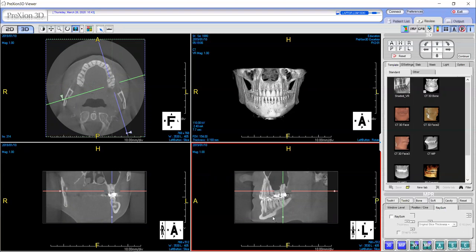So that is one way to manipulate your crossbars. The second option available is actually a shortcut using your alt key on your keyboard, and what I like about this shortcut is that we can utilize our 3D image. I'm going to quickly reset my crossbars to their original position by clicking the reset icon located on the upper right corner of your screen. I'll click reset and you'll notice my crossbars move back to their original default position.